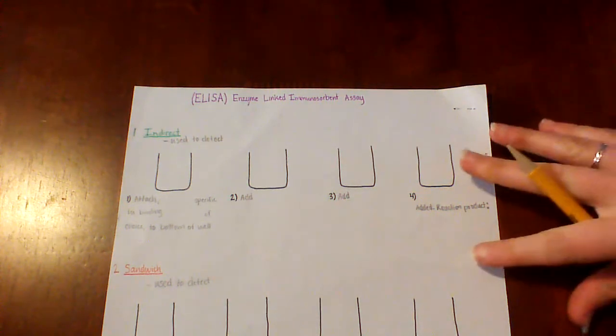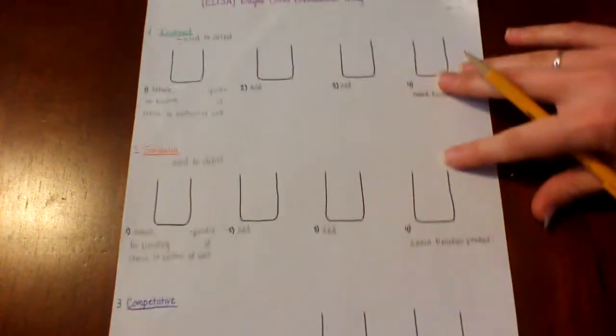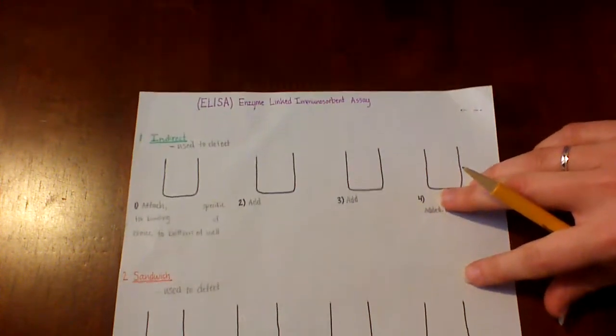For this video, I'm going to be talking about the ELISA assays. These are used for detecting antigens or antibodies in blood serum. And there are three different methods that are used: the indirect method, the sandwich method, and the competitive method. So for each one of these, I'm going to go through the steps and specify which method detects what and how they're used.